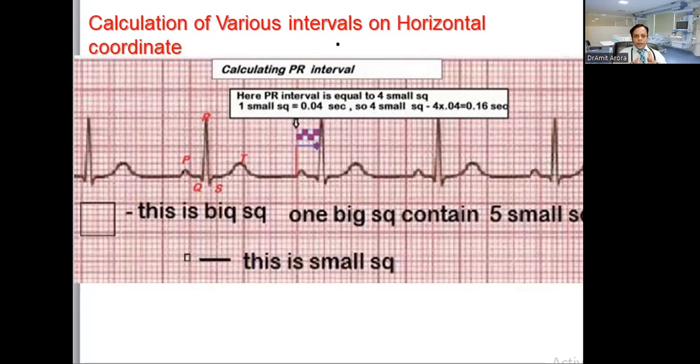If the heart rate is slow, then it will be bradycardia. If a person is walking or exercising, his heart rate becomes faster. So we can understand that. That is a normal physiological process. But the QT interval will also vary, though that doesn't mean the QT interval gets shortened. That's why we have to use Bazett's formula for correction. Most of you might know about that, but we will cover it during the program.